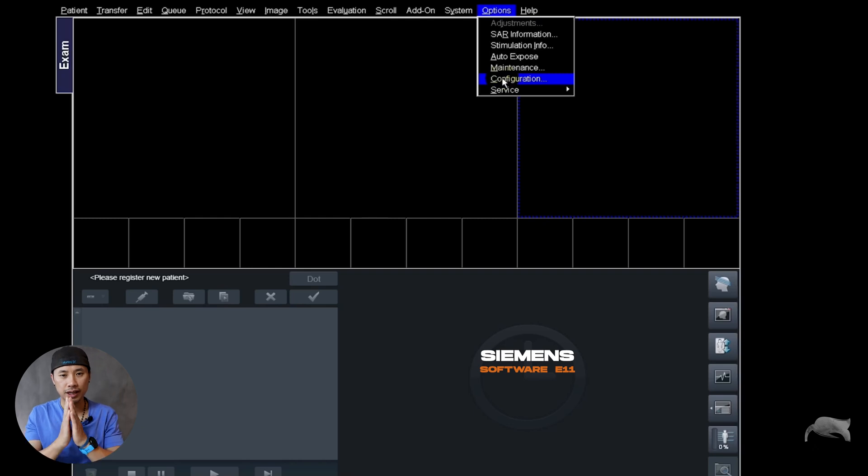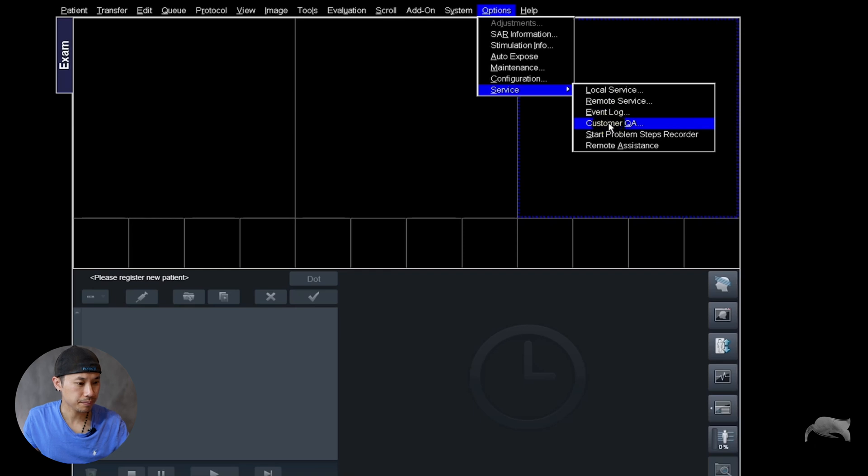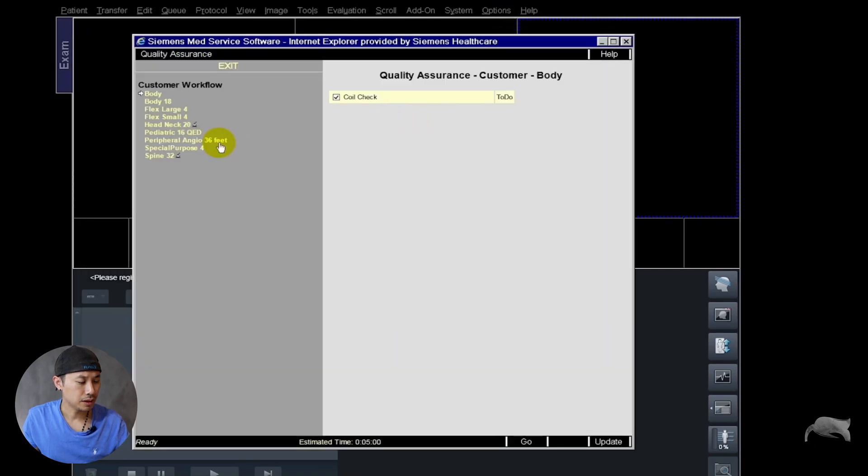Let's jump over to the eVA software, the older software. For those who are familiar with this software, you can go here to options, then service, then custom QA. Here you can see all the coils for this specific scanner. It's the same here — it shows 'to do,' but we already logged on and did all the tests there. So let's go for the body 18. You choose the body 18 which is connected inside the scanner and then just push go.